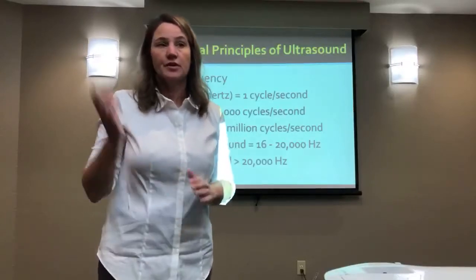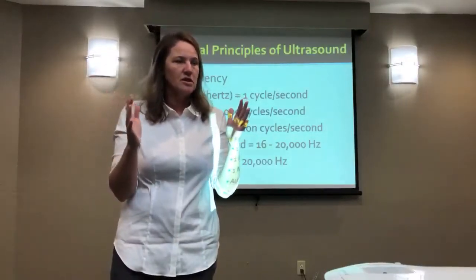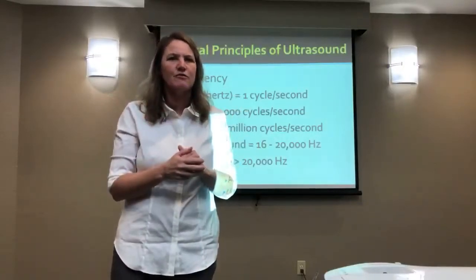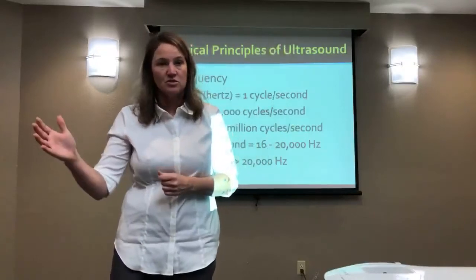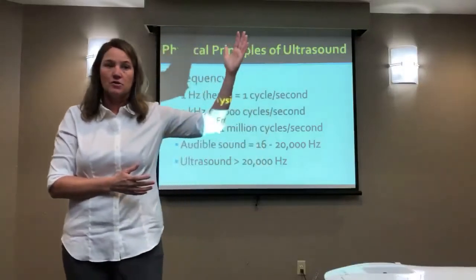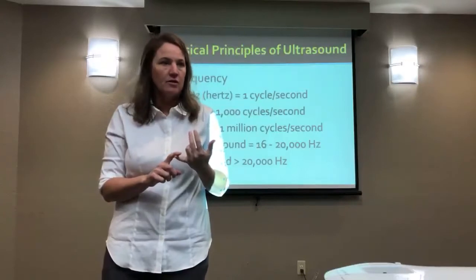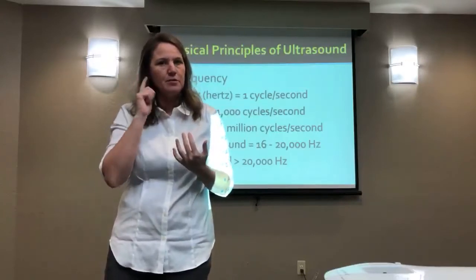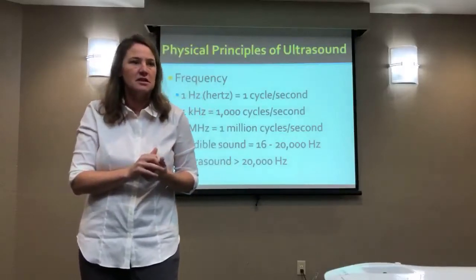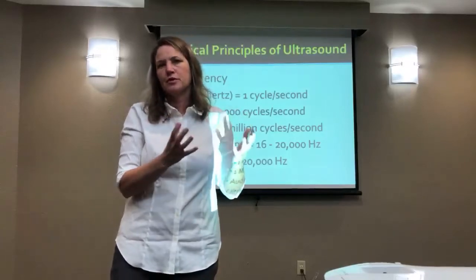What you can hear, the audible sound that we're capable of hearing is between 16 and 20,000 hertz. If you think about tone, think about what your voice sounds like, the frequency is what changes it. Low frequencies are deeper, higher frequencies become more high-pitched, and then beyond, you can't hear it because the vibration level doesn't travel well through air, and it's not capable of being perceived when your ear vibrates. In your capacity to hear it, you can't. Okay, so that's the idea of ultrasound and where the frequency is.